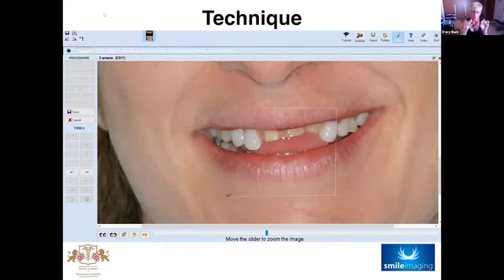So the way that we do it is we go dot to dot. So click, release, and if you draw a square box, click, release, you can go around and do perfect imaging every time. Okay, so that's what I'm doing. I'm just clicking and releasing and marking out the area. So I'm just going around, obviously, the 3 teeth this time, rather than the whole smile.